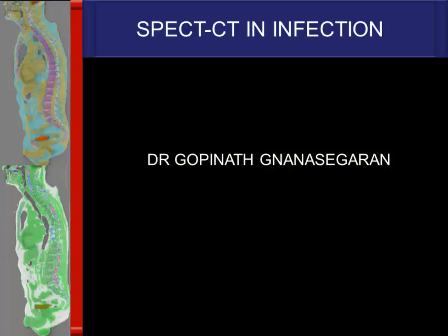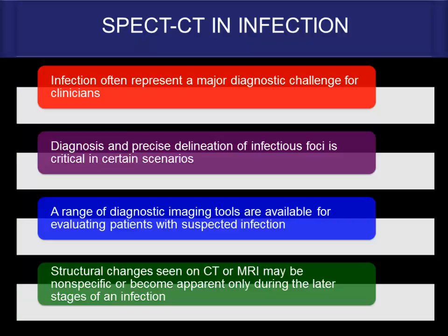Coming to the last 3 talks, I think so. So this will be one on SPECT-CT in infection imaging. Infection often represents a major diagnostic challenge. This is a slightly smaller talk. I'm not going to go into detail about the tracers and other things.